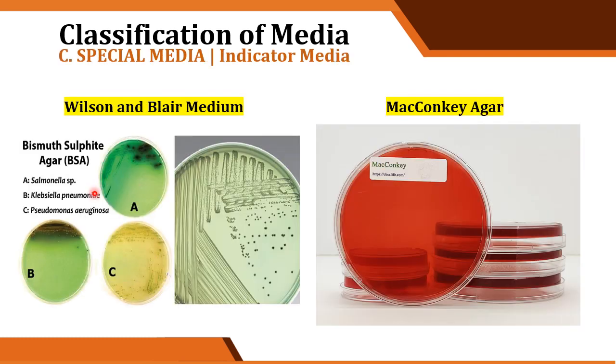Okay. For example, this one. Wilson and Blair medium. Okay. So Wilson and Blair has incorporated, sorry, sulfite. So it has sulfite, bismuth sulfite. Okay.